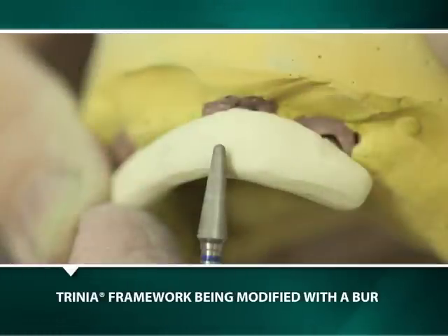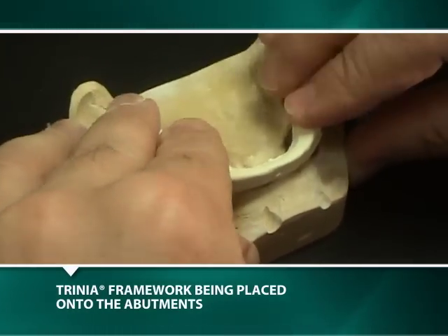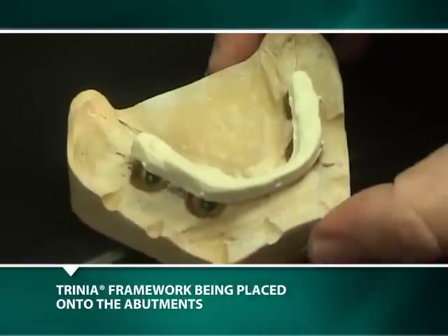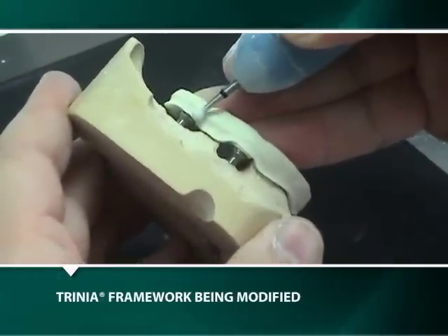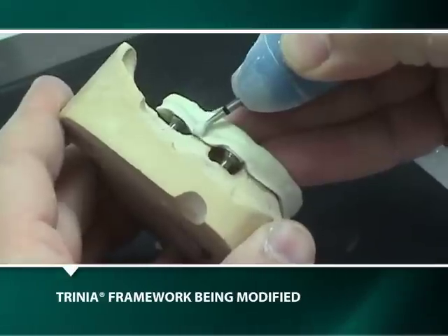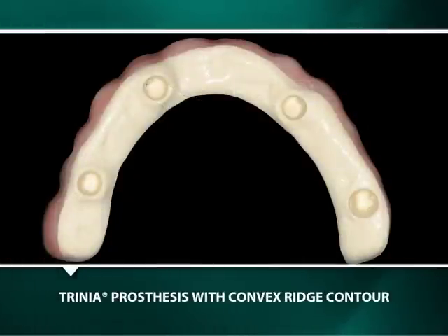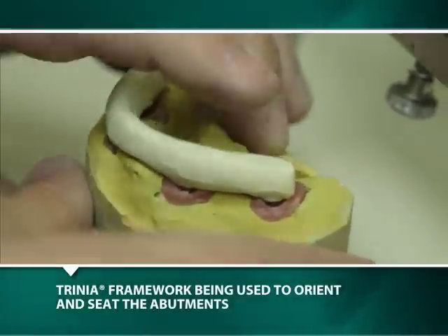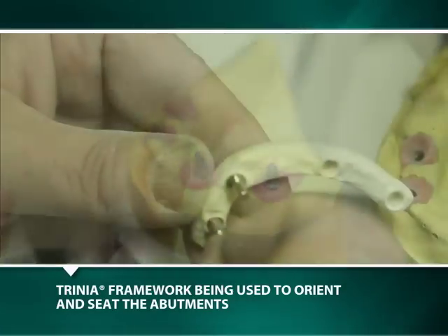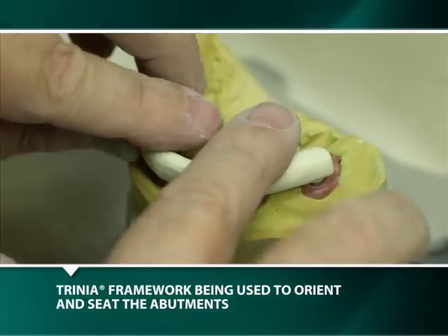After cleaning the milled TRINIA framework with alcohol, it is placed onto the milled abutments to evaluate and, if necessary, modify the marginal adaptation of the framework to the abutments and to the alveolar ridge of the model. The ridge side of the framework should be convex without any concavities. Additionally, the TRINIA framework is used to confirm both the path of insertion of the prosthesis and the sequence of insertion of the milled abutments on the model.